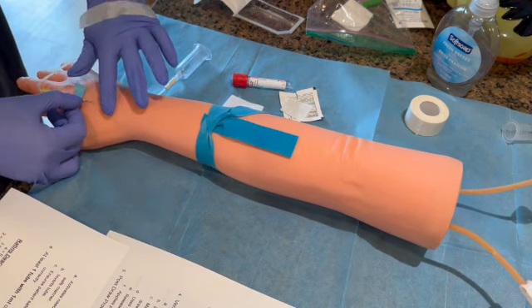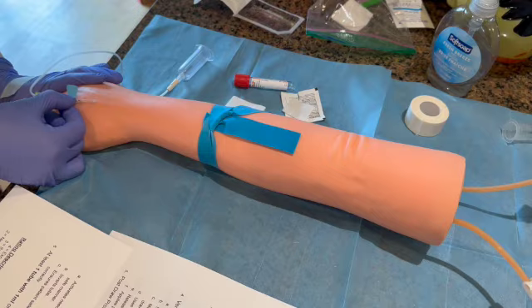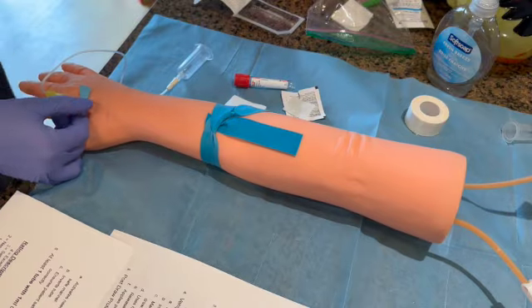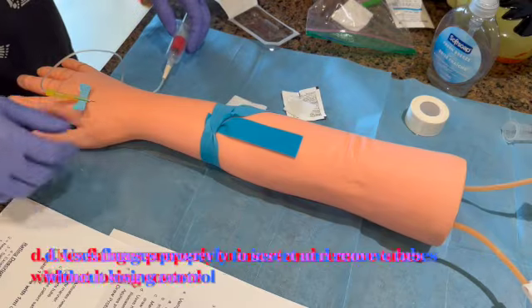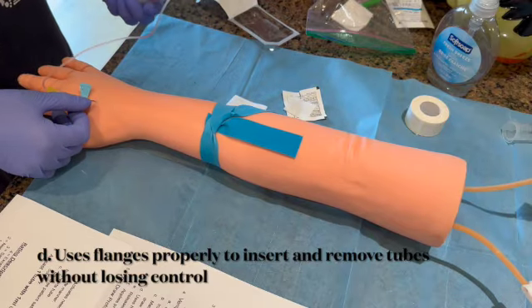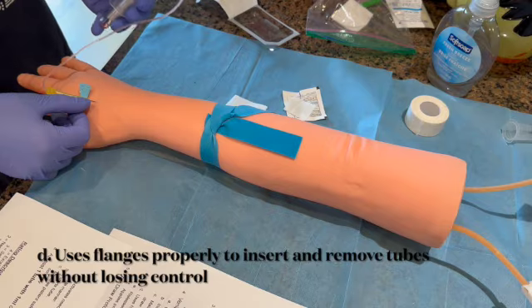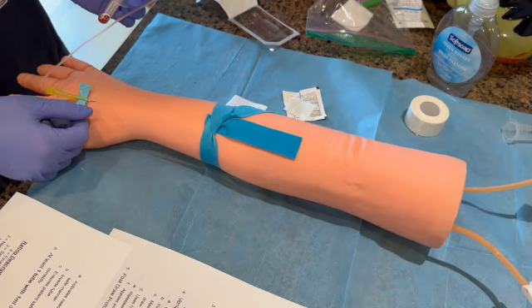Oh, I felt it. Come on, little guy, just give me blood. There we go. So we're there. I'm gonna want you to keep this. Robert's very rubbery, so I have no issue letting him go. But we're gonna attach our needle. I'm not sure if you guys can see the tube flowing through. The blood color is really, really light. As you get more in there, you'll probably be able to see.